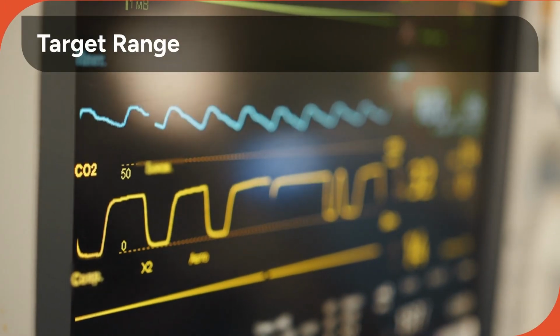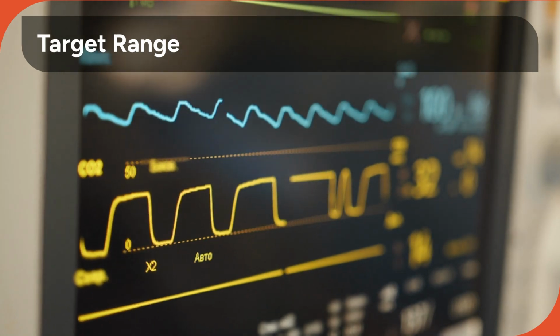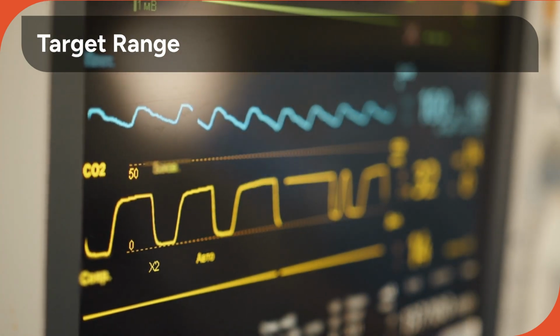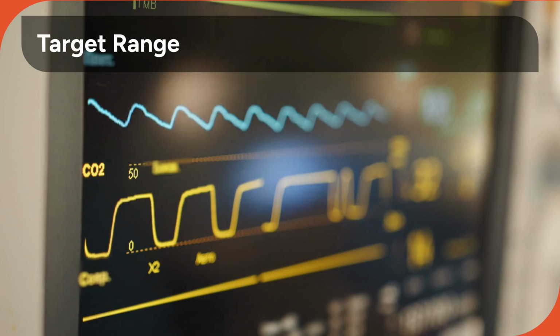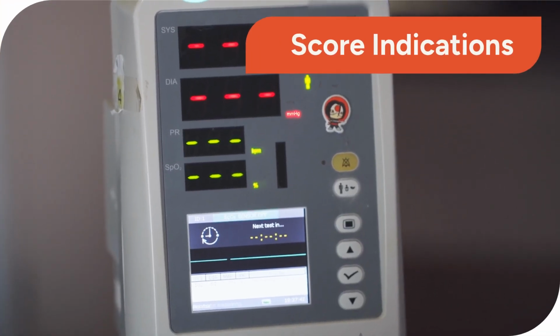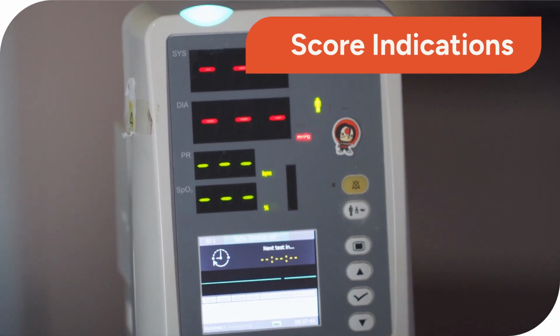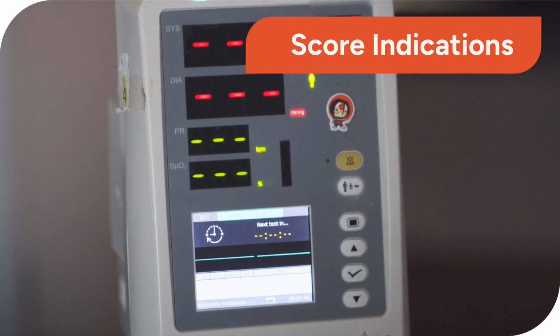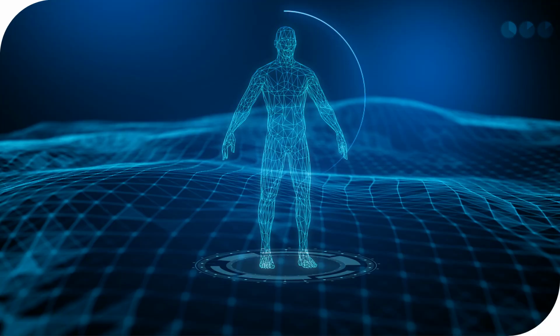For most surgical procedures under general anesthesia, the desired target range for the processed EEG index is between 40 and 60. This range is associated with a low probability of awareness. A score above 60 suggests the patient may be too light and at risk of awareness, while a score below 40 indicates deep anesthesia, which may be associated with prolonged recovery times.